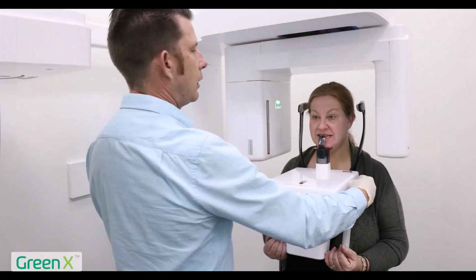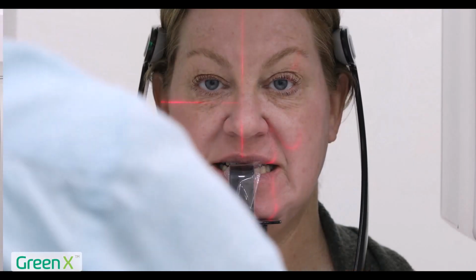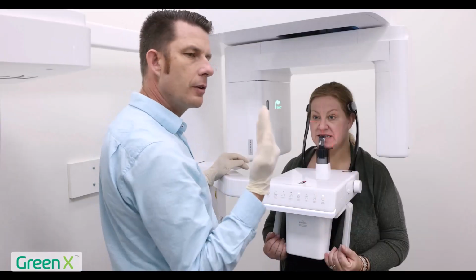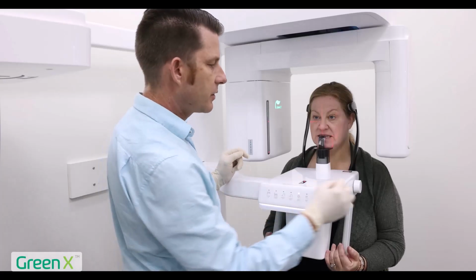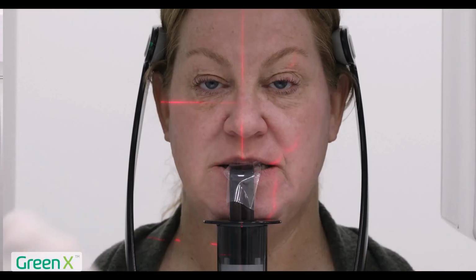Next, I'm going to go ahead and close my temple supports and line the canine beam just mesial the canine, or just in front of the canine, specifically for our bite wing feature. Smile really big again. All right, go ahead and relax.